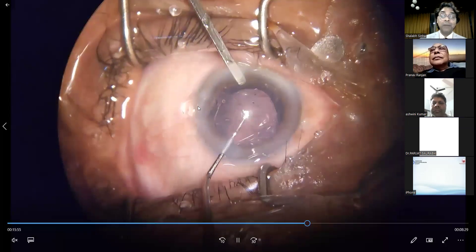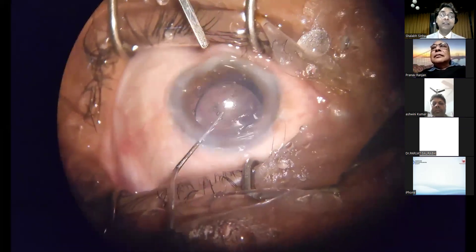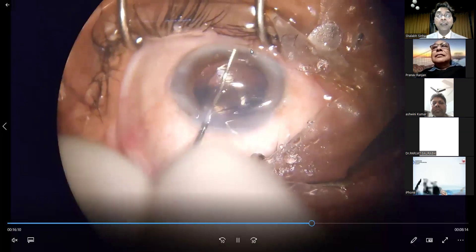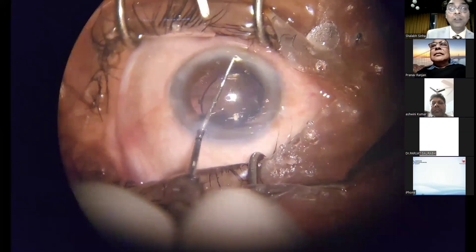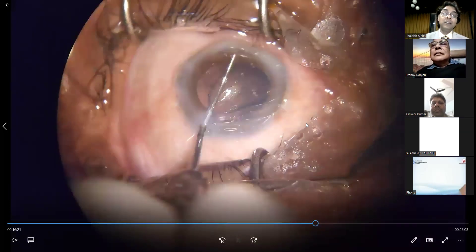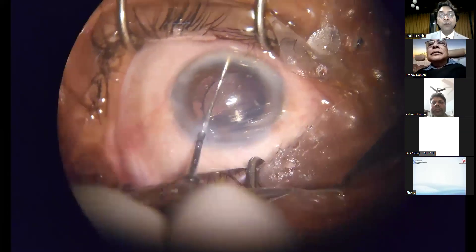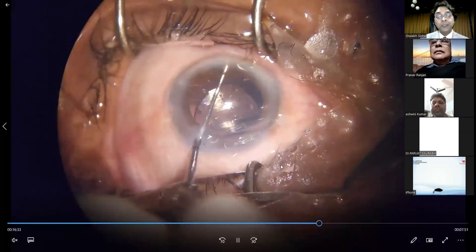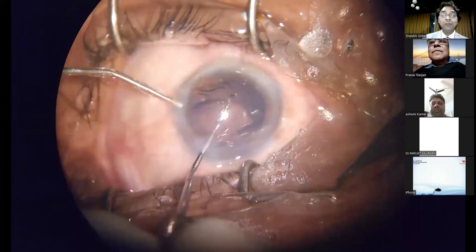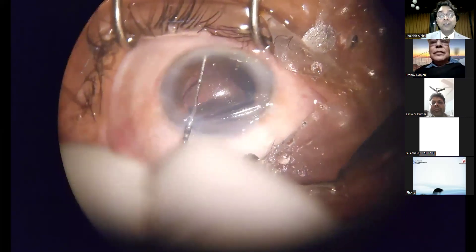It was a good thing that I had the haptic out. However, I made an error in judgment — I thought I would dial the lens into position above the iris, hoping the other pole would prolapse into the anterior chamber as well. This is what I should not have done. You can see me struggling; the anterior chamber is becoming shallow with folds in the cornea. The situation is very precarious because the lens is ready to dive into the vitreous cavity.